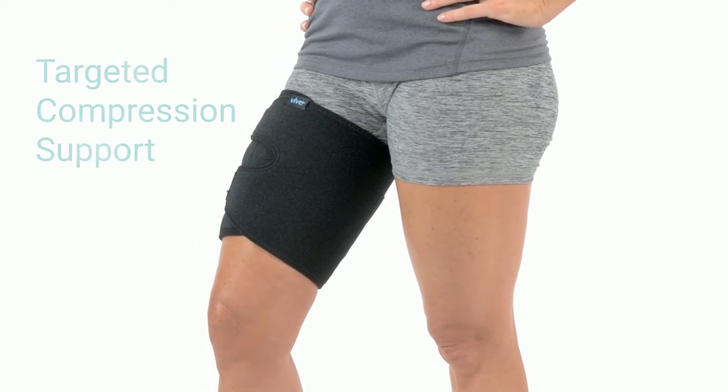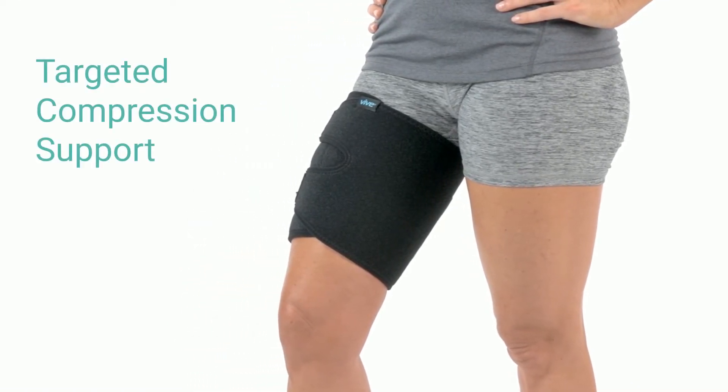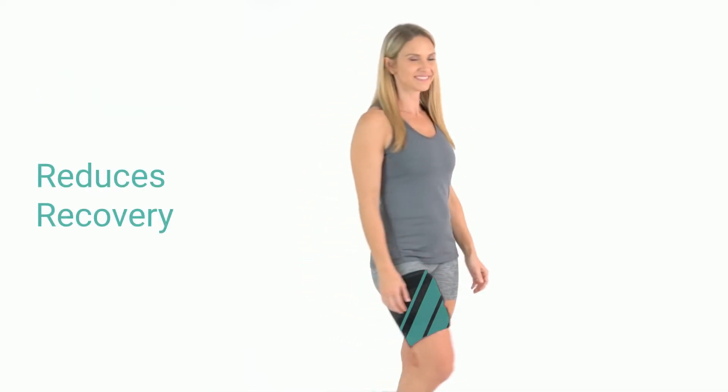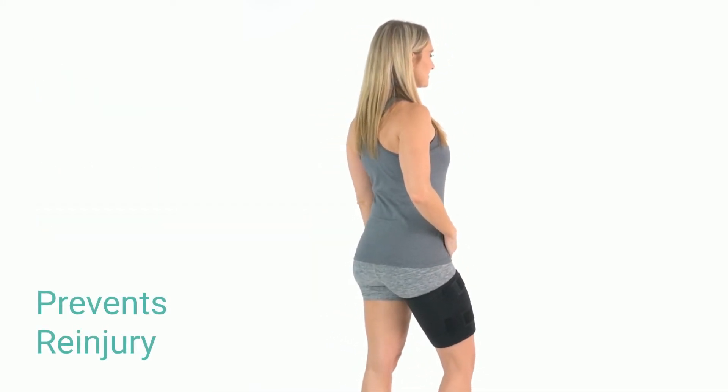The Thigh Brace by VIVE provides targeted compression support for hamstring and quadriceps. Effective for a variety of injuries, the brace promotes healing, reduces recovery time, and prevents re-injury.